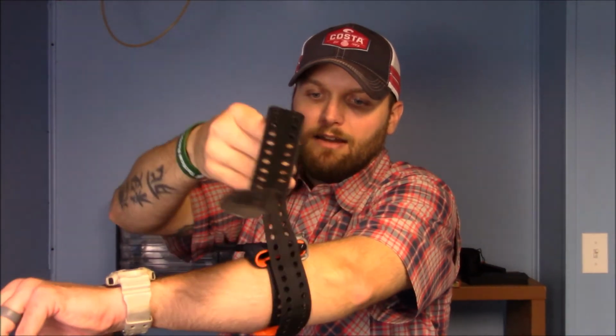Now the rest of the Velcro is literally just to keep that from flopping around. So you would crank this down, lock it down inside that little channel just like a cat tourniquet. And then it of course has a little piece that goes over and secures the windlass in place, and where you can write the time that the tourniquet was applied.